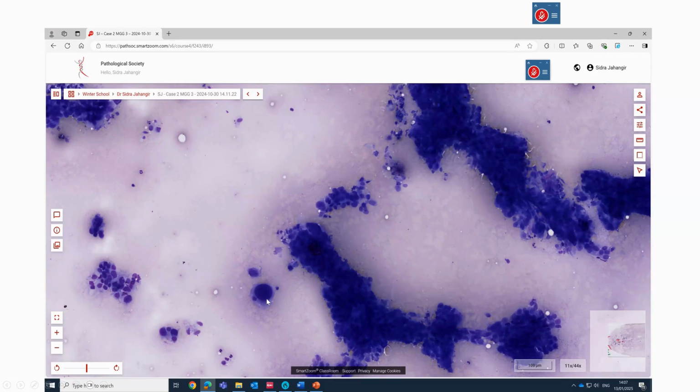So malignant ductal groups, staghorn-like clusters. You can clearly appreciate big, large nuclei, haphazardly arranged, crowded ductal cells with overlapping, hyperchromasia, pleomorphism, single isolated cells. All the features required for the diagnosis of adenocarcinoma are there. So this is a cytology smear slide from the same lesion.